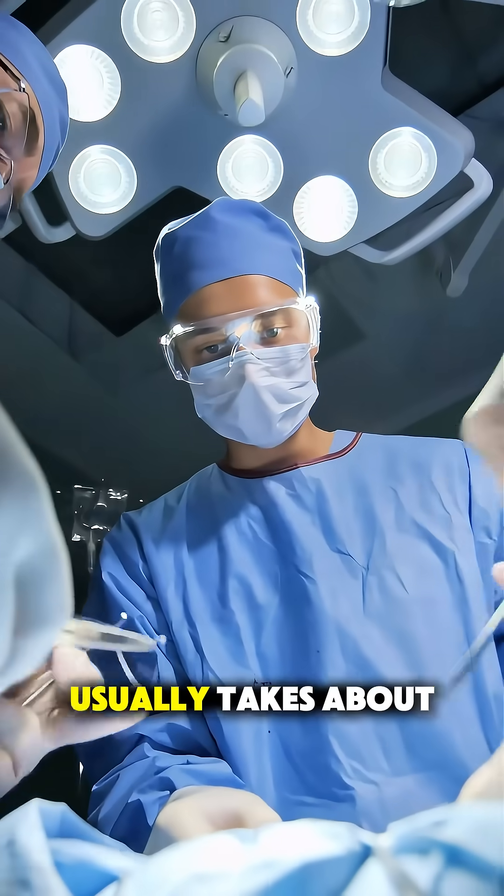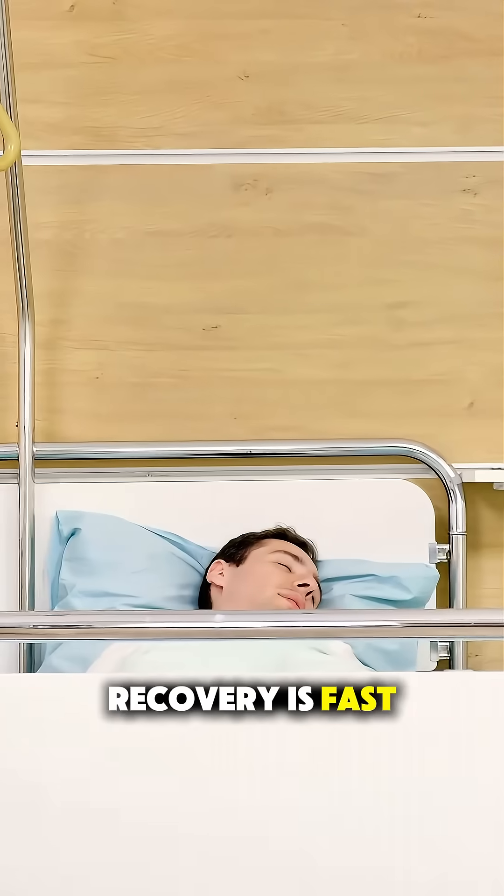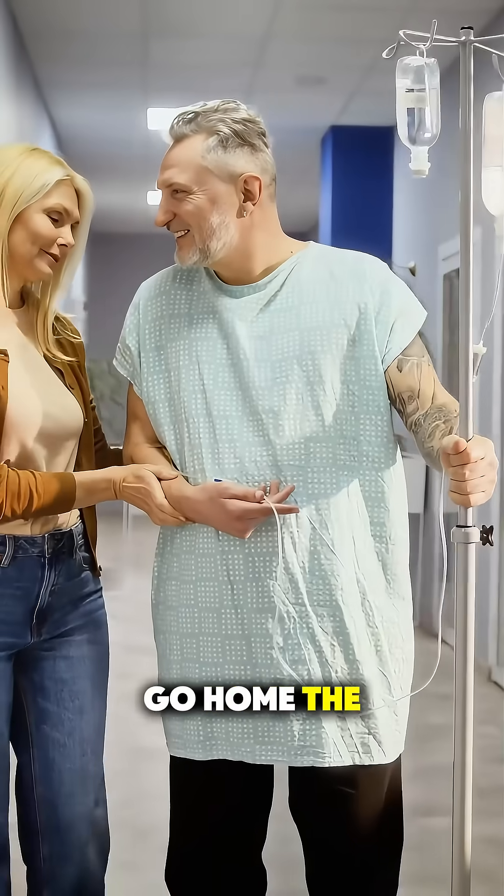The entire procedure usually takes about 30 to 90 minutes. Recovery is fast, and many patients go home the next day.